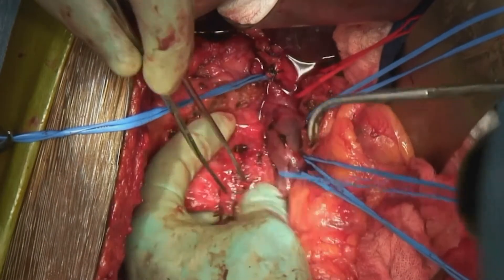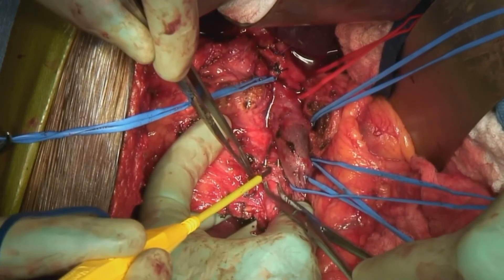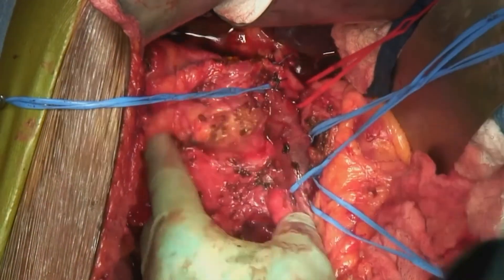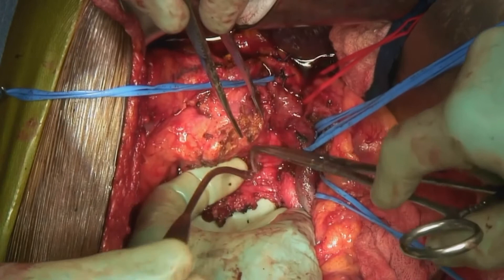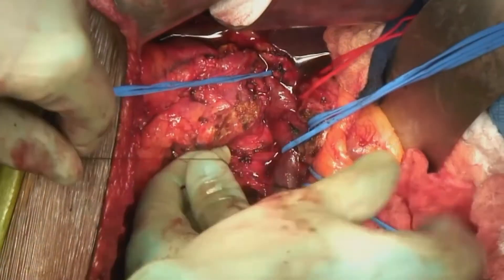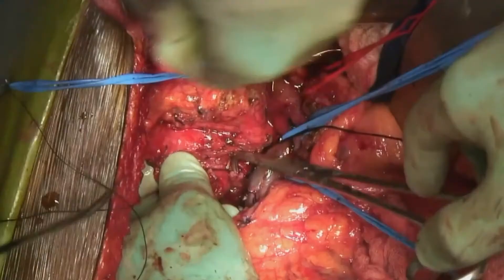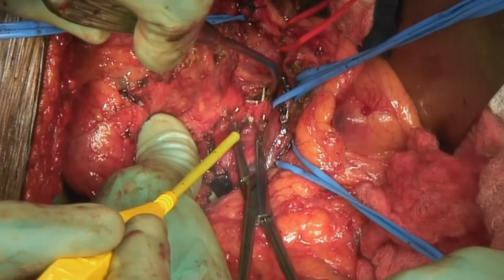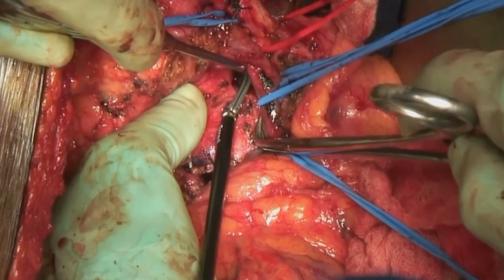The soft tissues directly superficial to the palpable superior mesenteric artery are opened with electrocautery to expose the adventitia of the anterior surface of the artery. Once this proper plane has been established, it can be safely developed cephalad along the right lateral aspect of the artery. During the dissection, care must be taken to identify and individually ligate the inferior pancreaticoduodenal arteries. We typically doubly ligate these arteries with silk and Prolene sutures prior to transection. Dissection is continued along the peri-adventitial plane and at the cephalad-most aspect connects with the plane established by the hepatic artery node dissection.